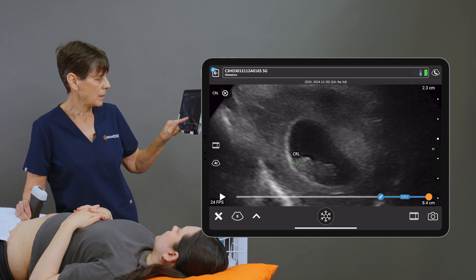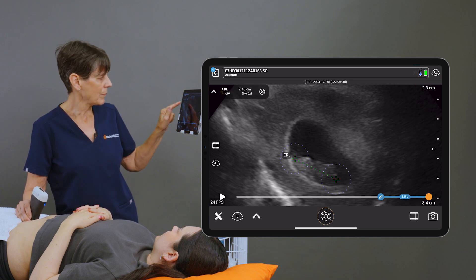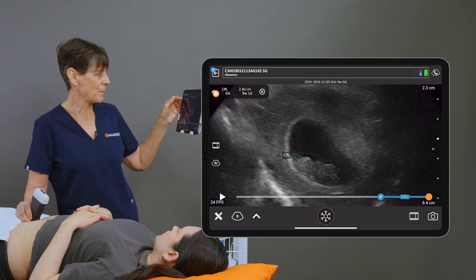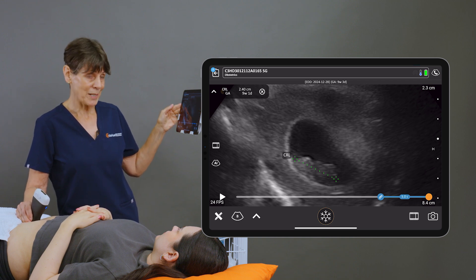I'm going to place a caliper at the crown of the head as well as the rump, and I'm getting the crown rump length displayed at the top left, as well as the corresponding gestational age. We can see that that corresponds well with the due date that we've already entered.